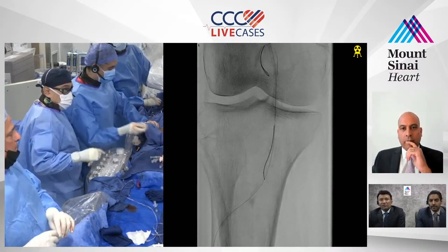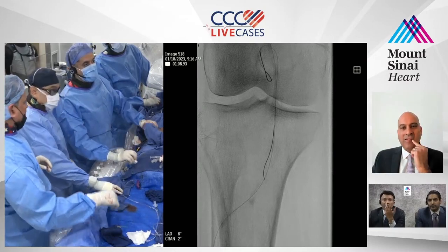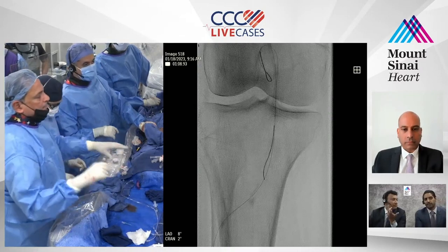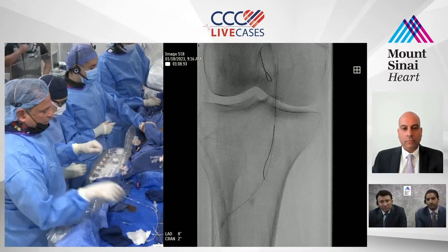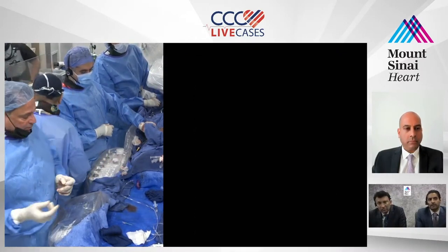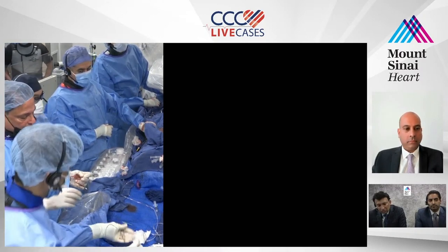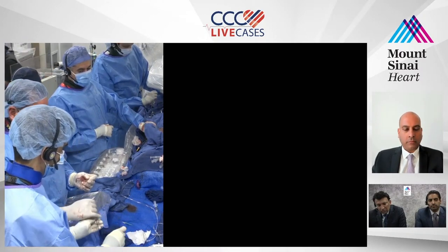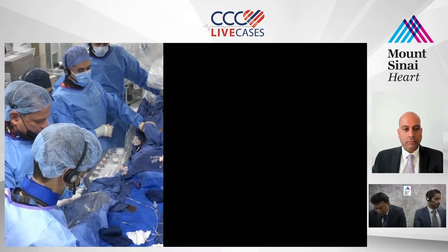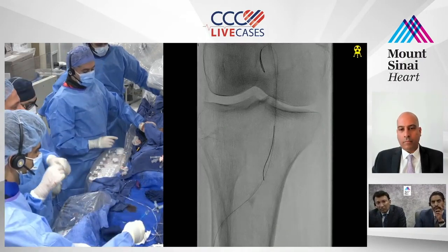Maybe also doing it in the straight segment of the AT. There's a loop on the top. What is that? That's just in the collateral. Oh, okay. Maybe also going from the straight segment of the AT, not having to worry about so many angulations. But you don't want to take the wire across the balloon segment. Can I have the 035 Navicross, guys? Right now, I think we can easily wire from here. Or we can take an Aqua Tempo if you want, or a JR4. Any one of those catheters we can go through. The angle of the Navicross is good. Smooth. I think it'll also track the plane better.